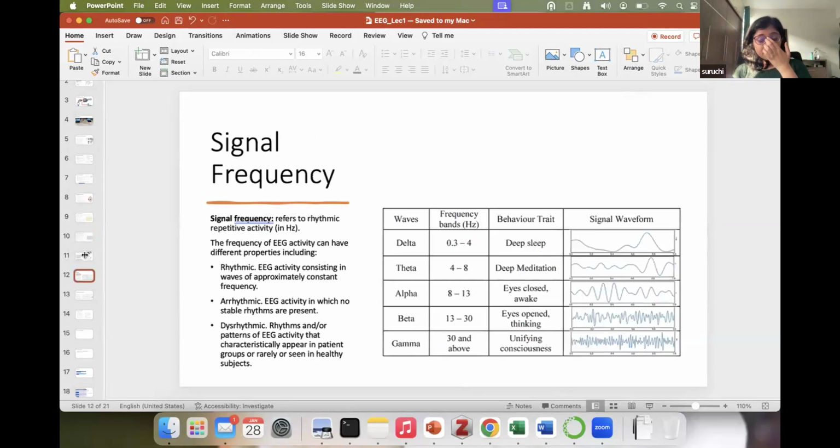So whenever we are talking about frequencies now, forget the sampling rate. That is how many times it was calculated, so the raw data will have that many data points for every channel. After that, we will plot each channel's signal against time, which is what raw data means, and then how many peaks we see in it, that becomes the signal frequency. Okay?